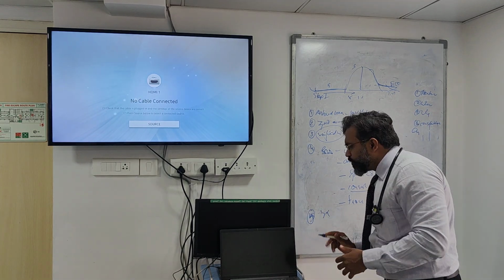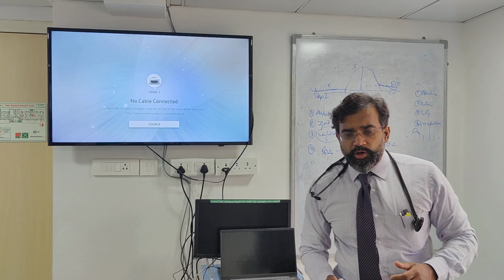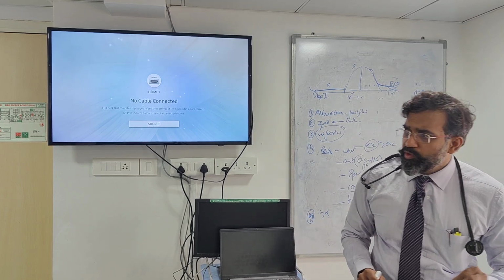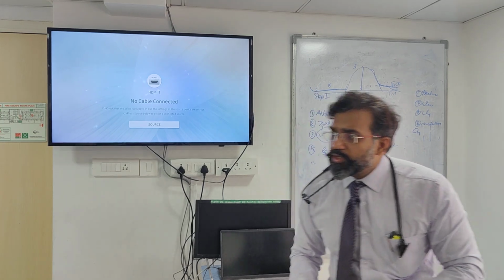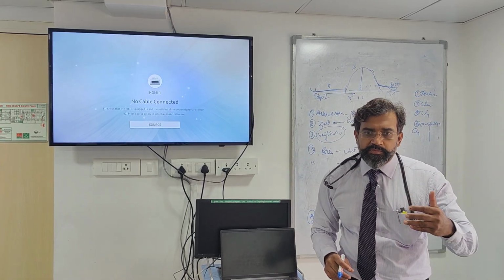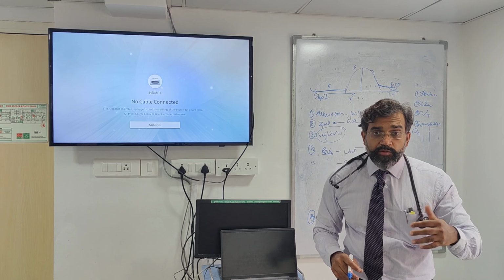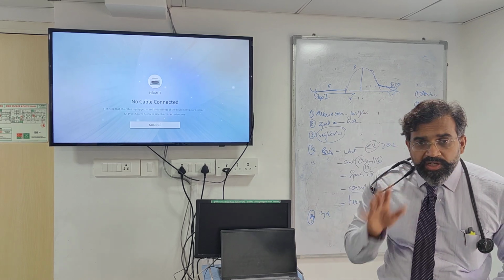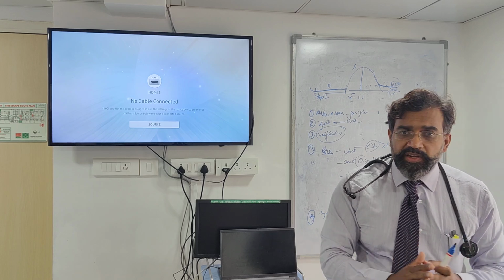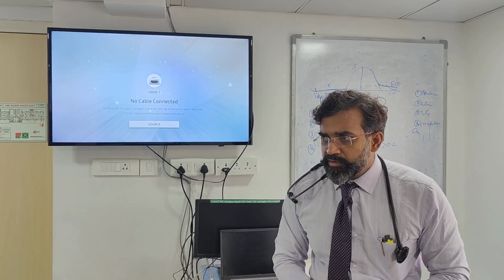And why do I do it 3 times? Because I want to improve the precision of my measurement. And to improve the precision of my measurement, I need to do the investigation 3 times. And what am I doing in those 3 times? I am looking whether the cardiac output is varying by more than 15%.